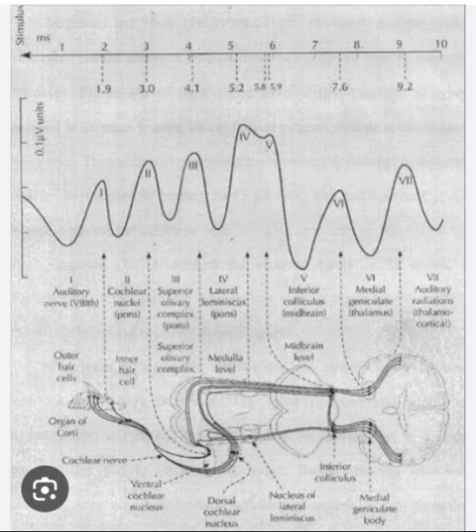Basic concepts. BAER measures the electrical activity generated in the auditory system in response to auditory stimuli. The stimuli consist of clicks or tone bursts presented to the individual's ears, and the neural responses are recorded using electrodes placed on the scalp. These electrical responses are amplified, filtered, and averaged over thousands of trials to produce the BAER waveform. To properly interpret the BAER waveform, it is crucial to understand the basic terminology and concepts behind the BAER test.